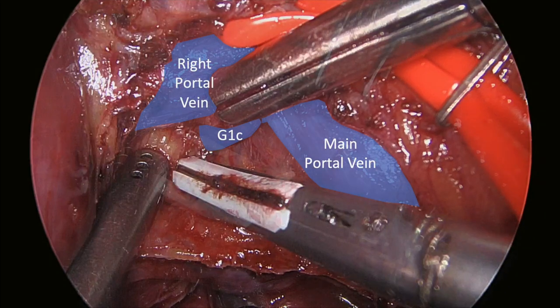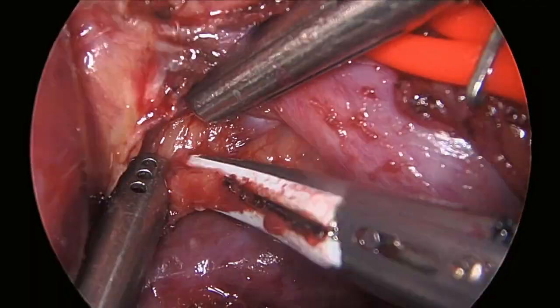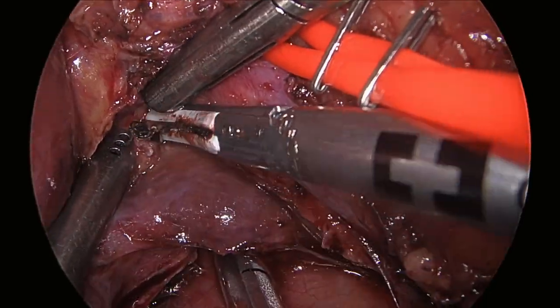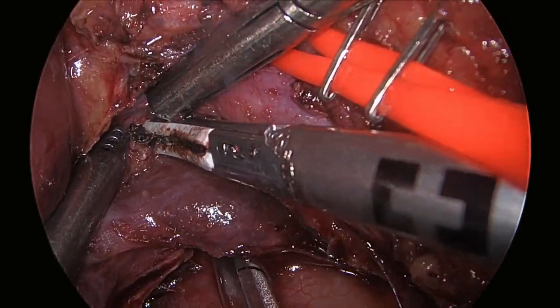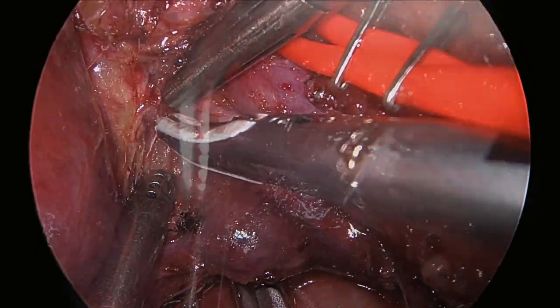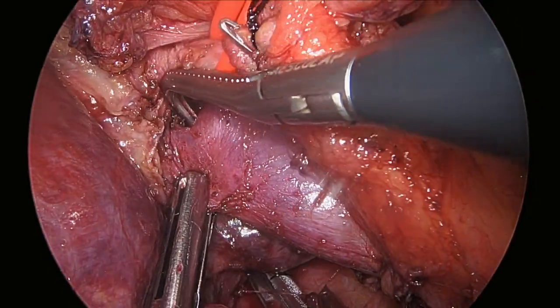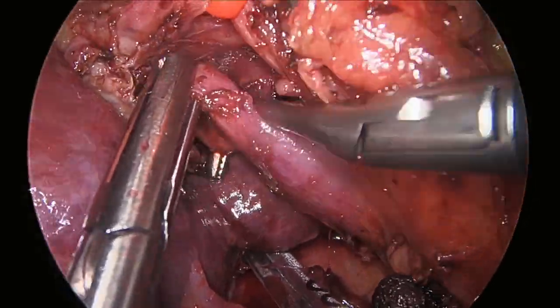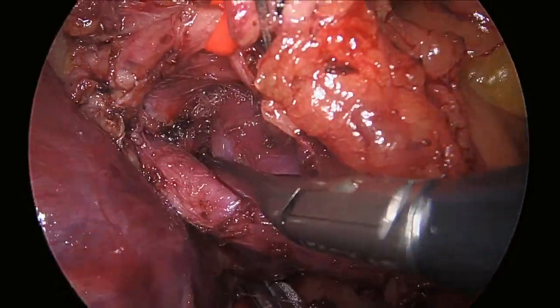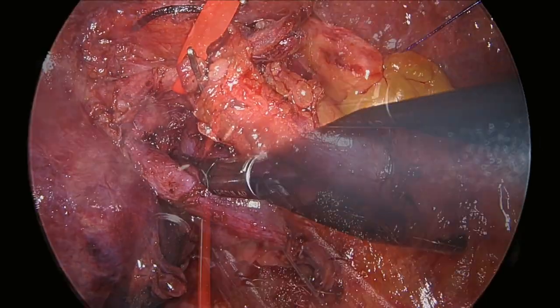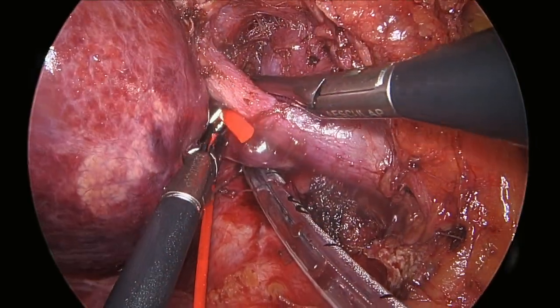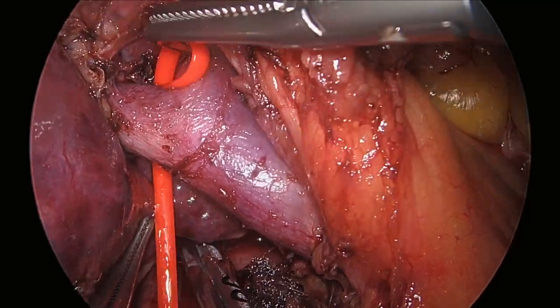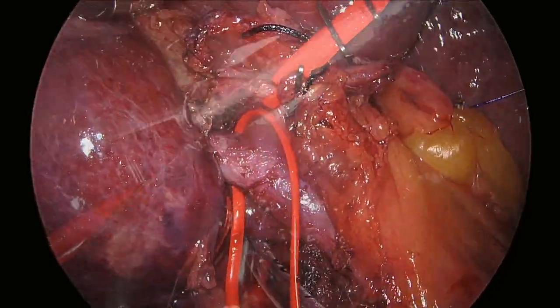Typically this caudate branch is ligated in a right hepatectomy. However, in this case, with a large caudate lobe in a cirrhotic patient, we opted to preserve this vein. We isolated our main right portal vein distally to this branch. Thankfully, the portal vein embolization was further intraparenchymal from here, allowing us a good distance on our right portal vein to allow for extrahepatic control.